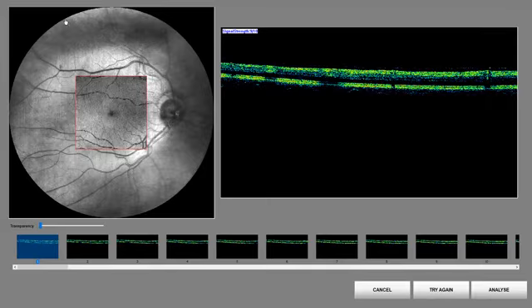As we can see here, there are no interruptions, which means that the patient hasn't blinked or moved the eye. Here we have horizontal 256 scans and the same at vertical level. So we are going to have about 65,000 spots in this area.